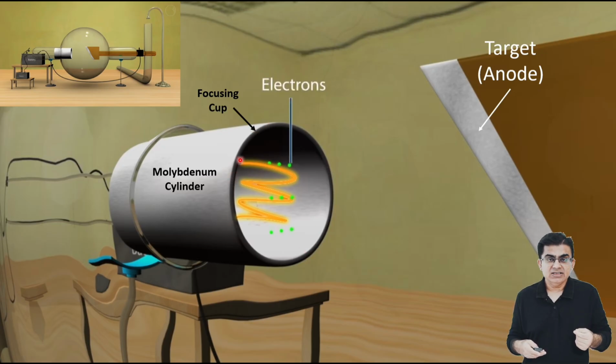This negative charge strongly repels the negative floating electrons from all sides. It forces them to stay tightly packed together right in the center of the cup. This simple design beautifully shapes our electron cloud into a very fine focused pencil beam. Now they are perfectly ready to aim at the target and waiting to be fired.